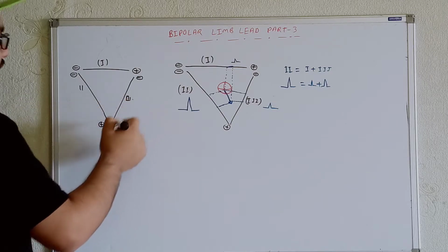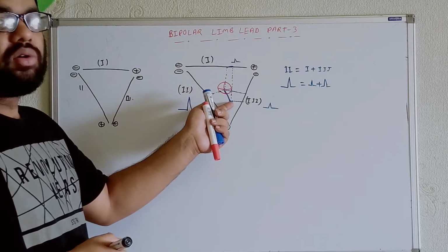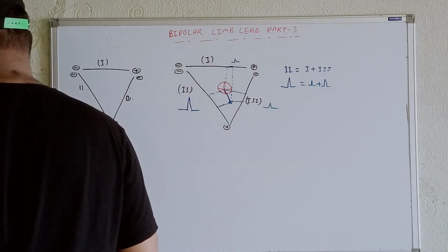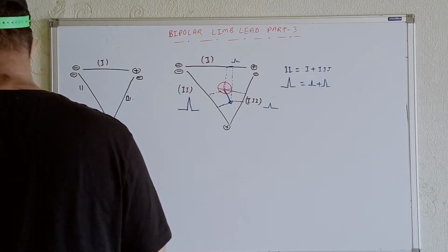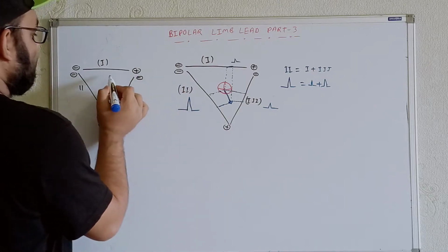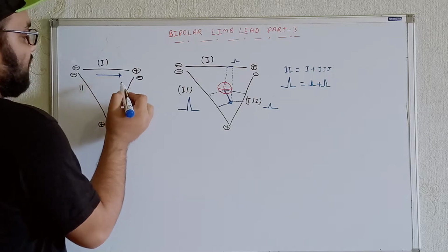Now, for example, we are getting the major ventricular depolarizations, normally leftward and downward. Normally, what we see over here, or rather, if we get, okay, let's see over here. For example, we are getting the major ventricular depolarizations in these directions.